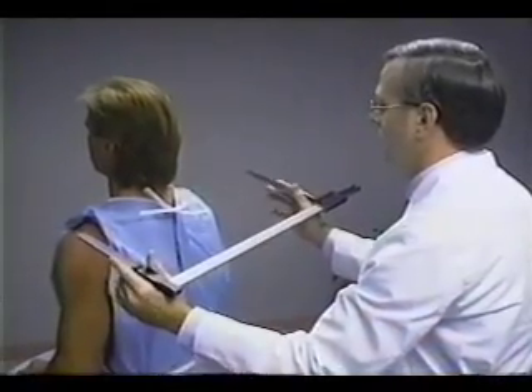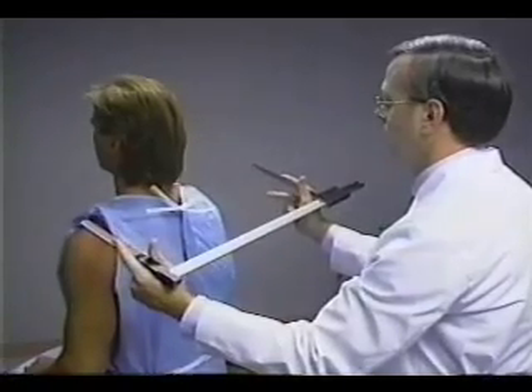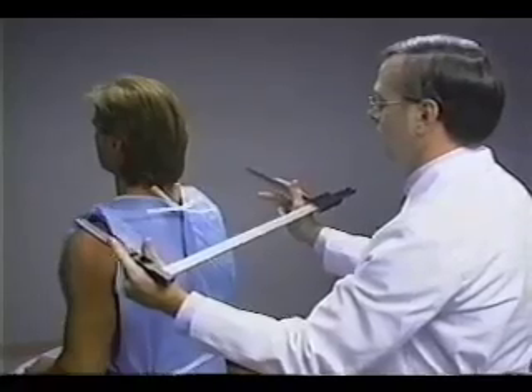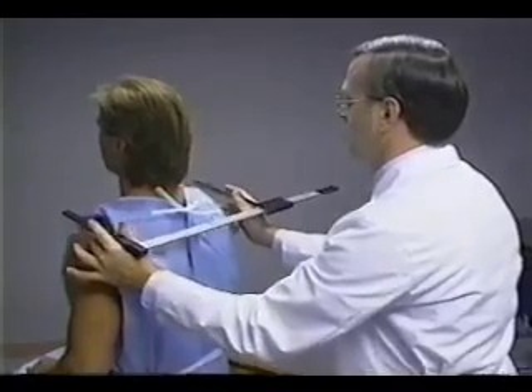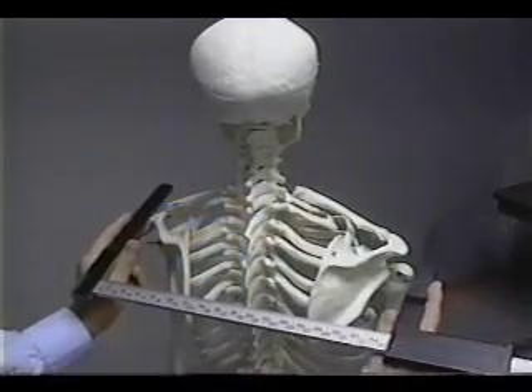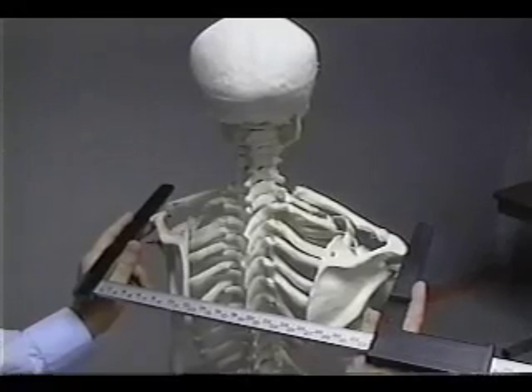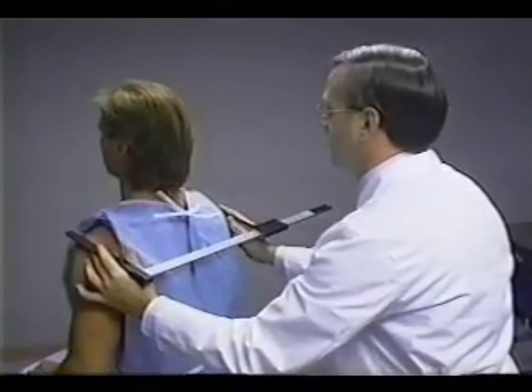The shaft of the broad blade caliper rests at the base of the thumb and index finger of both hands. The technician uses the middle fingers to palpate the ridges of the acromial processes. When the lateral borders of the acromial processes are located, the bars of the sliding caliper are placed directly on them, with the shaft aligned parallel to the shoulders.